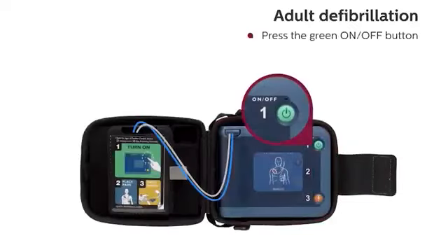To start the defibrillator, press the green on-off button and follow the HeartStart FRX's voice instructions.